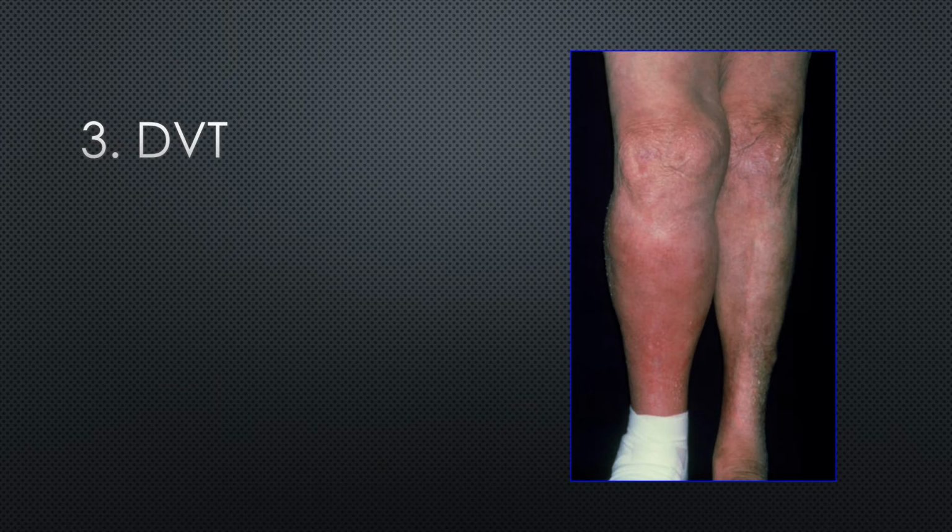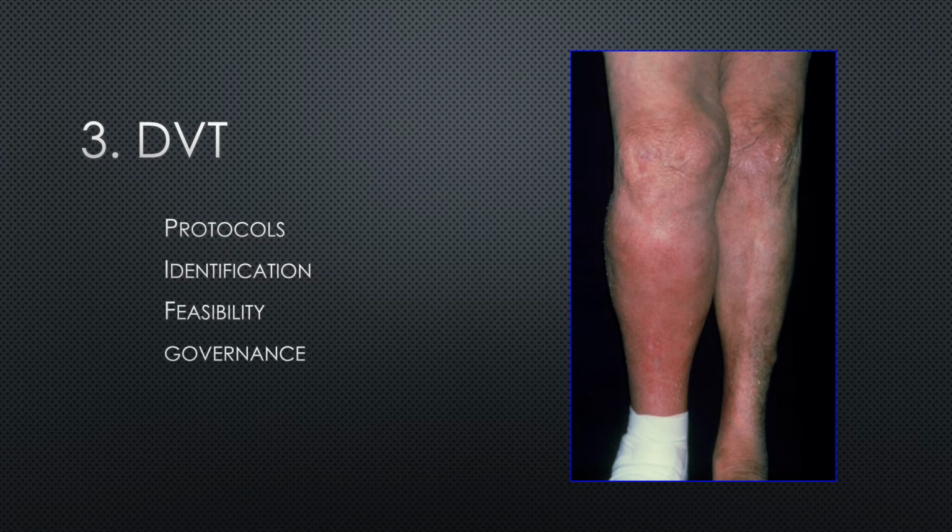And the third and final component of the triple PoCUS is DVT. So we'll talk about the protocols, how to identify a DVT, feasibility, and governance.